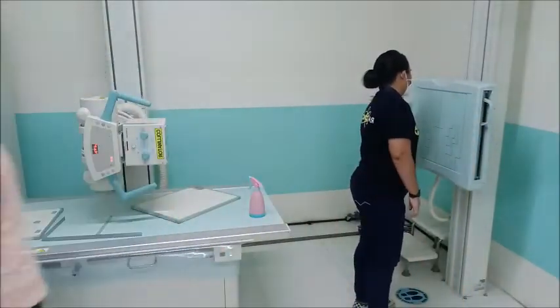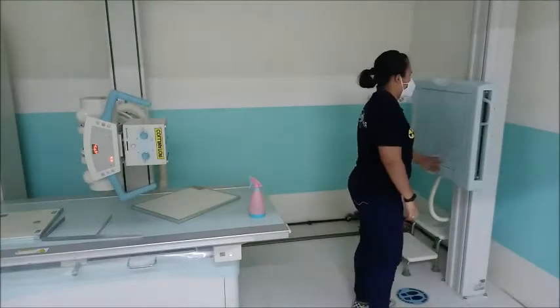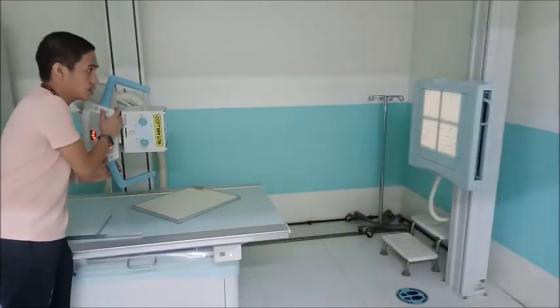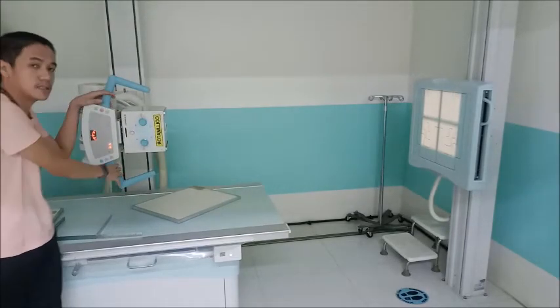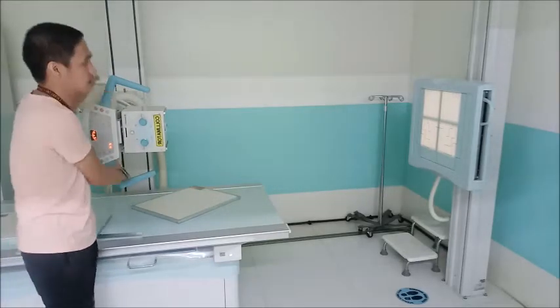Then after locking the IR in place, make sure to adjust your collimation to the size of your cassette. So we have 14 by 14, and then the SID is already set to 72 inches. 72 inches SID.